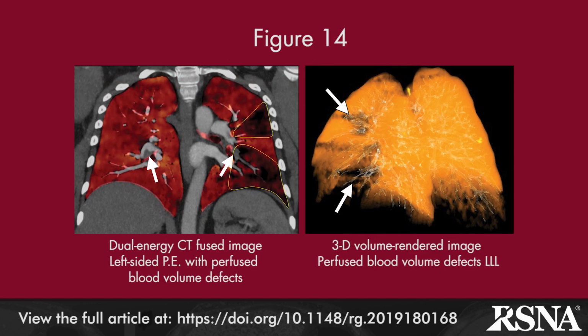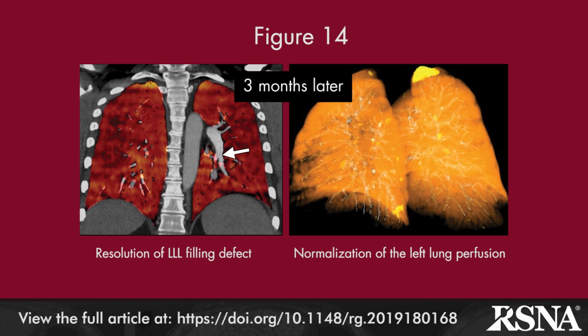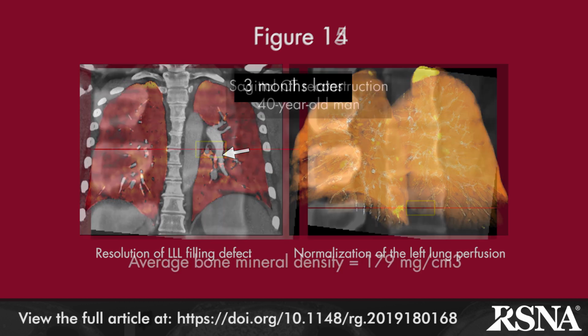Dual-energy contrast-enhanced chest CT with iodine mapping of the lung as a biomarker for pulmonary perfusion correlates with the severity and prognosis of pulmonary embolism, with strong correlations of degree of vascular obstruction and right ventricular to left ventricular ratios with serum troponins and overall patient prognosis. Dual-energy biomarkers of lung perfusion also correlate with the severity of pulmonary hypertension as determined by pulmonary artery pressures.